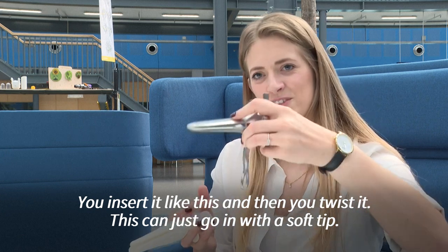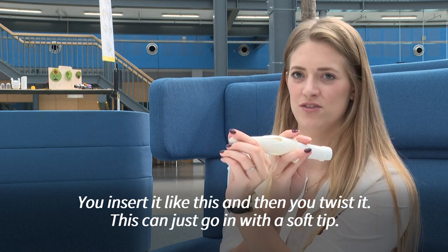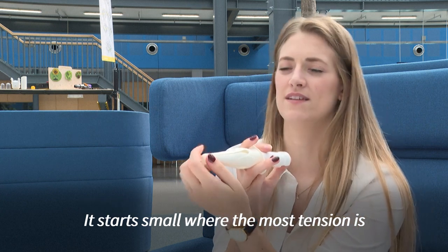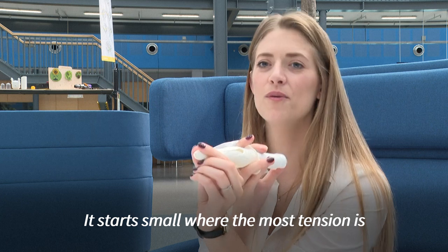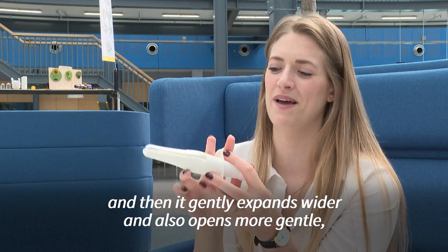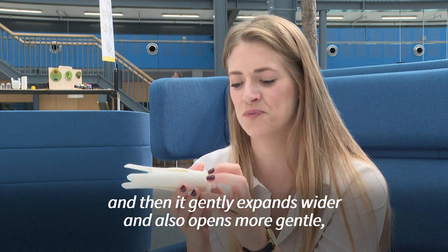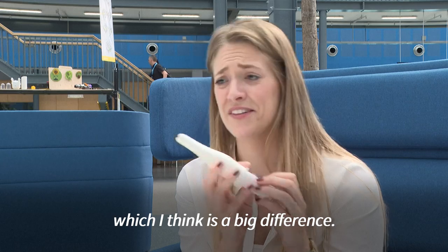You insert it like this and then you twist it. This can just go in with a soft tip — it starts small where the most tension is, and then it gently expands wider and also opens more gently, which is a big difference.